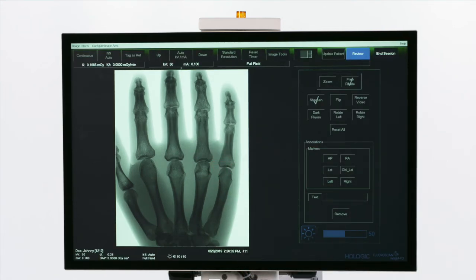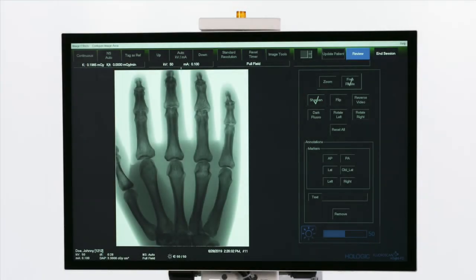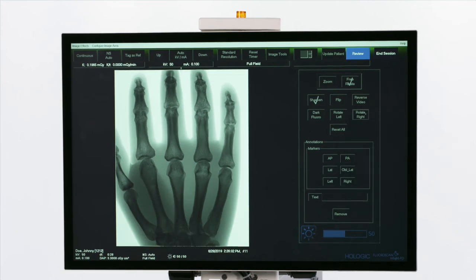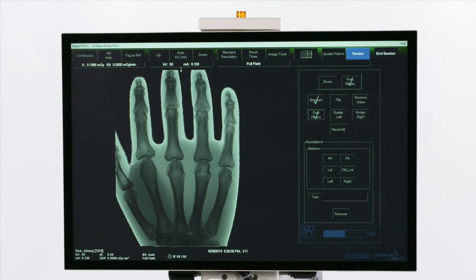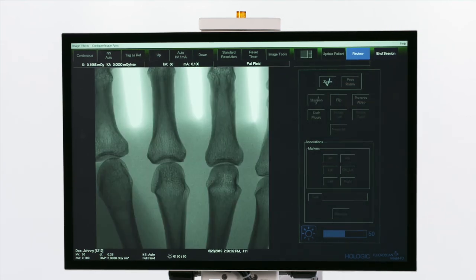We will now review the image tools, which allow you to edit the image. Sharpen is defaulted on always. Rotate rotates the image counterclockwise or clockwise. Flip makes images flip before being viewed by the user. Dark fluoro makes images have their white image pixels changed to black. The zoom button magnifies the current image two times.